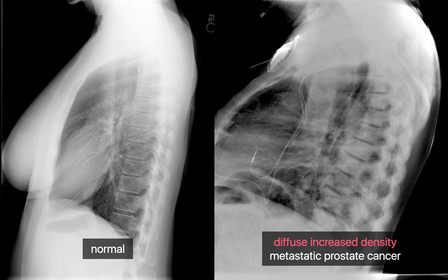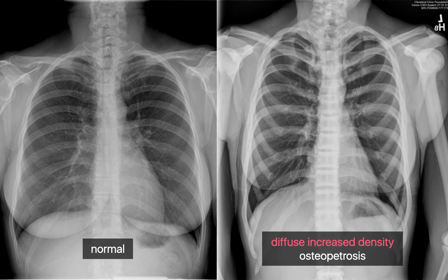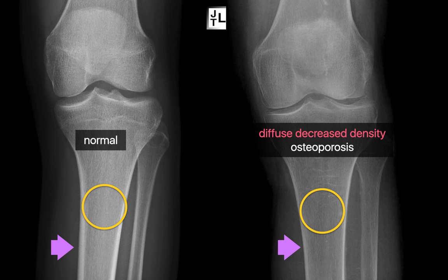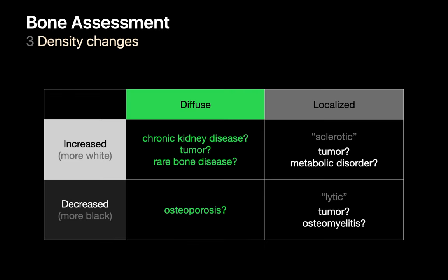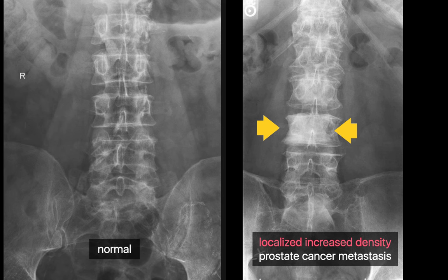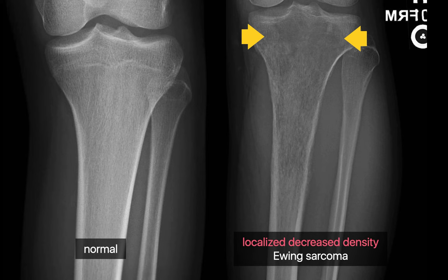Here's an example of diffusely increased bone density in the setting of metastatic prostate cancer to bone. Here's an example of diffusely increased bone density in the setting of a rare bone disease known as osteopetrosis. And here's an example of diffusely decreased bone density in the setting of osteoporosis — notice how the cortical bone appears thinner too. When the density change is localized, always remember to consider tumor regardless if you observe localized density increase or decrease. Here's an example of localized increased bone density in the setting of metastatic prostate cancer to the lumbar spine, and here's an example of localized decreased bone density in the setting of a primary Ewing sarcoma in the tibia.